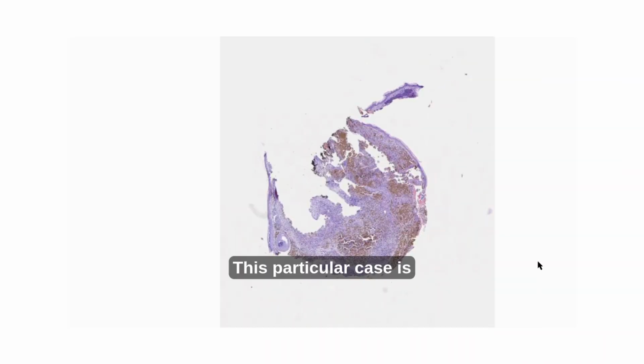This particular case is a skin neoplasm, and it was received in our consultation. It comes from a 69-year-old female with a scalp nodule that was clinically diagnosed as a basal cell carcinoma.